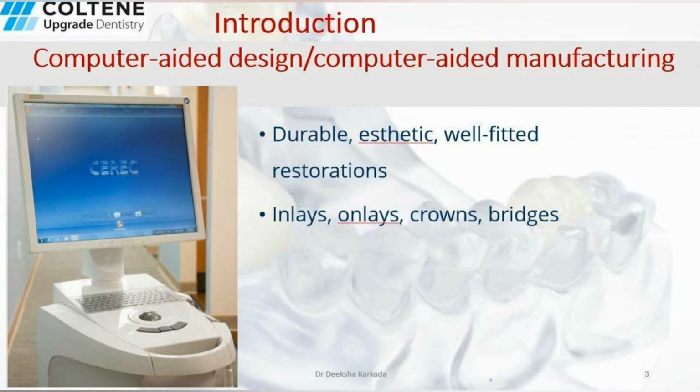CAD/CAM is an acronym that stands for Computer-Aided Design, Computer-Aided Manufacturing, which helps the dental team fabricate precise shapes and sizes for dental restorations, including inlays, onlays, crowns, and bridges. This CAD/CAM technology provides patients with durable, aesthetic, well-fitted single and multiple tooth restorations in a more efficient manner.